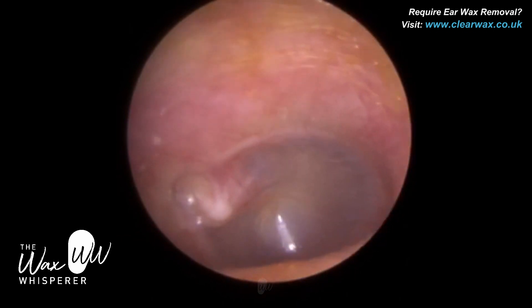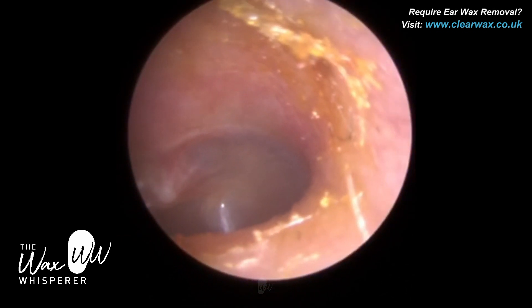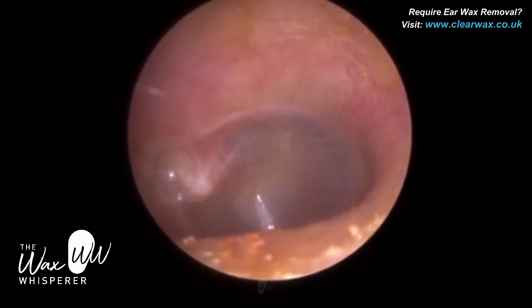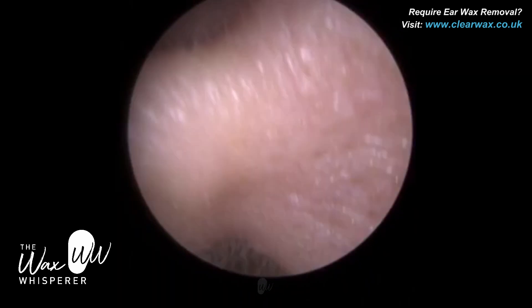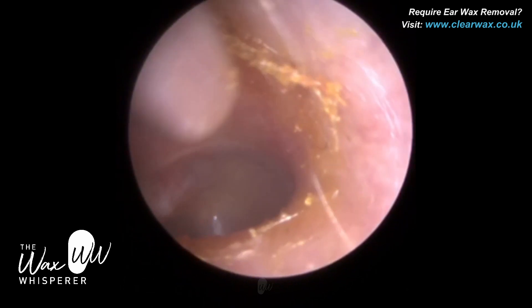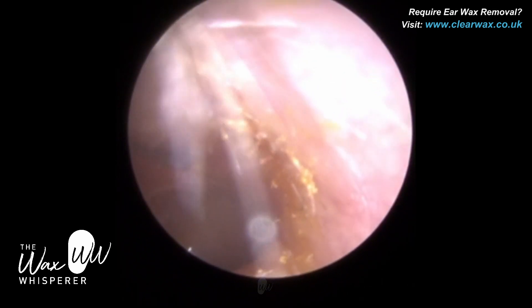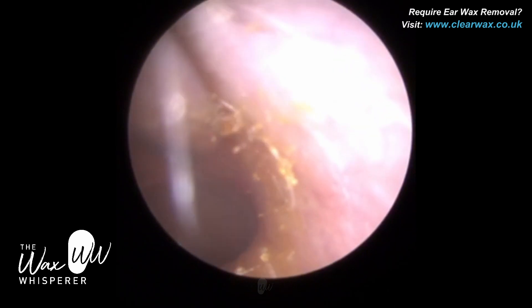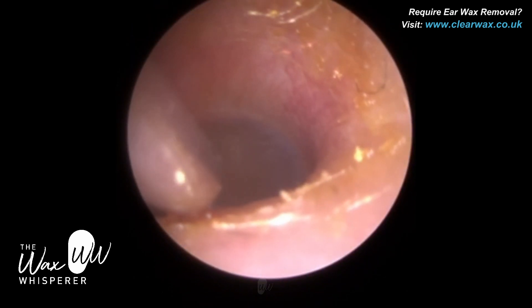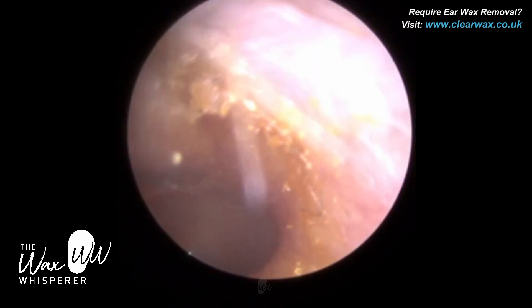The patient also had underlying eustachian tube dysfunction. You can see that's the eardrum — the top part of the eardrum is sucked inwards. There's a little pocket, and I'm just focusing on that now, to the left of the circle on the screen. That's an attic retraction. The attic is the top part of the eardrum, also known as the pars flaccida, whereas the main body of the eardrum is called the pars tensa. The pars flaccida is a bit more elastic and thinner, whereas the pars tensa is a bit more muscular and rigid.